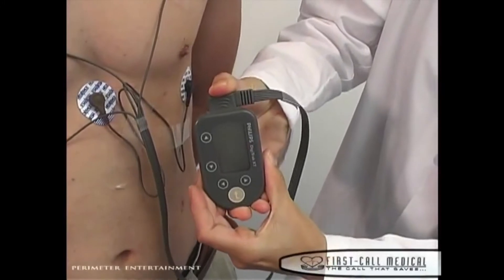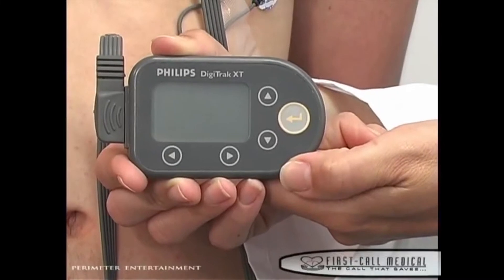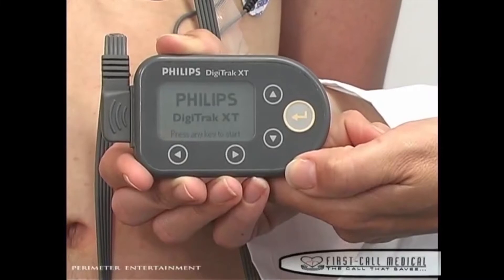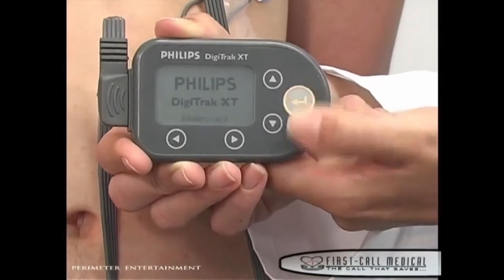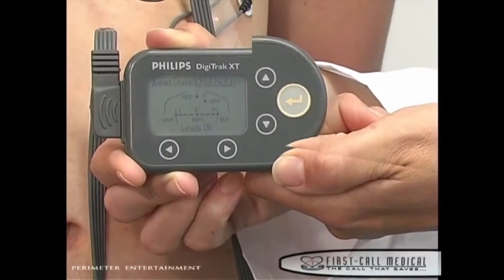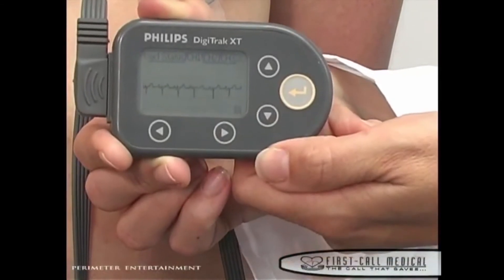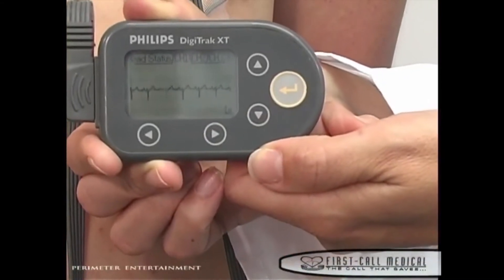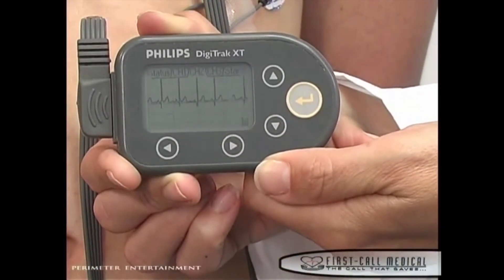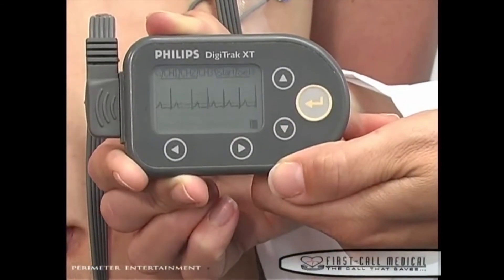It is now time to start the monitor. Press the gold start button in the lower right corner of the monitor. You will see the status of your holter hookup. Press the gold start button and you will see a message at the bottom of the screen. Press the right arrow button to view the patient's EKG waveform scroll by on channel 1, then press again for channel 2, and again for channel 3.